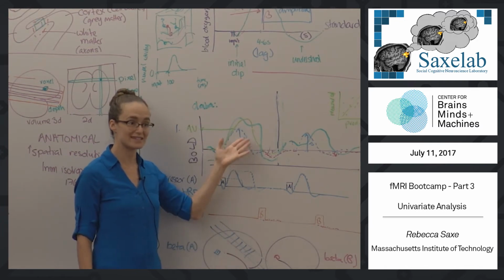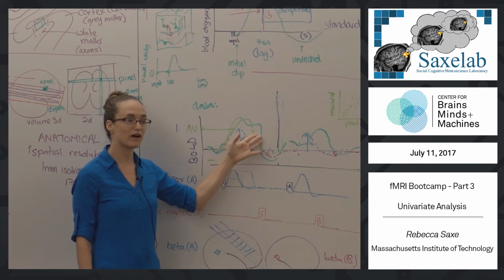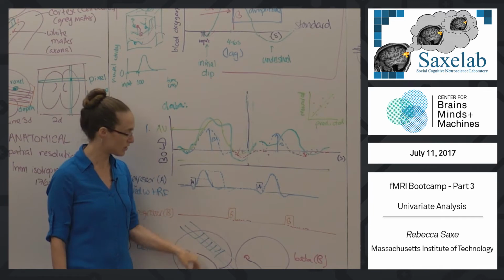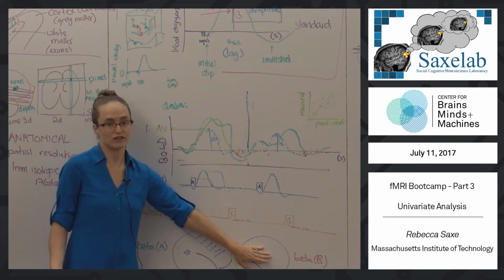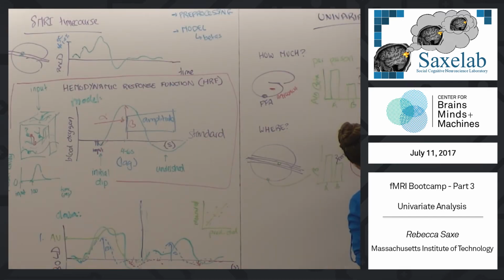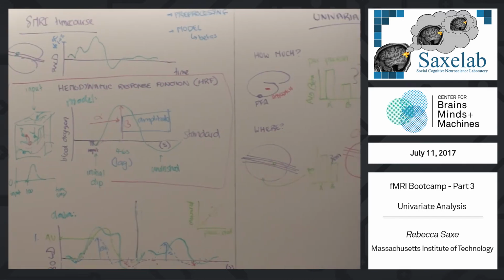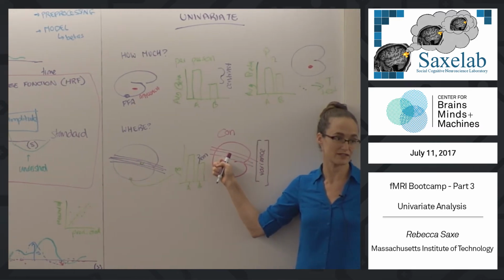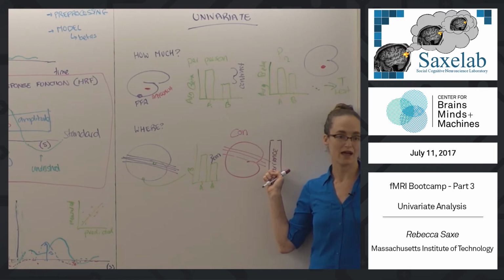But we could go back to the data and ask, how well did our model actually fit the data? Right? So at every voxel, we know what our beta values were. But we could also have kept track of how much unexplained variance there was after we fit that model. Does that make sense? Because as Todd says, different packages do this differently. But in addition to knowing the con for each voxel, so that is the difference of the betas, we can also know how much unexplained variance was there in that voxel after we fit those betas.